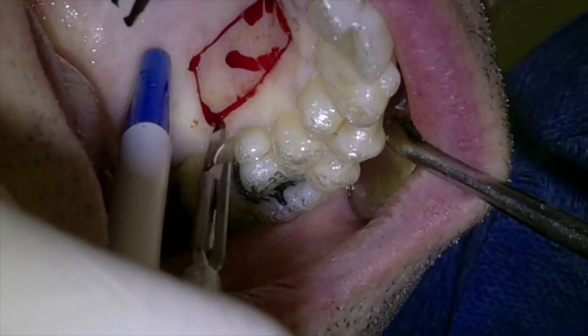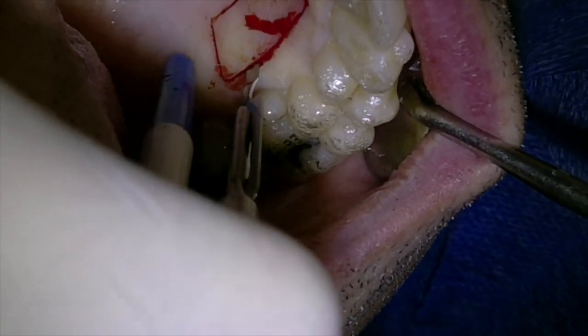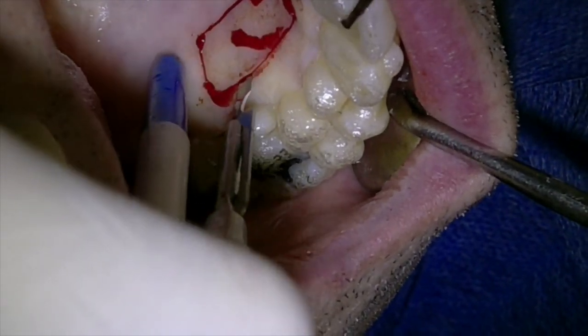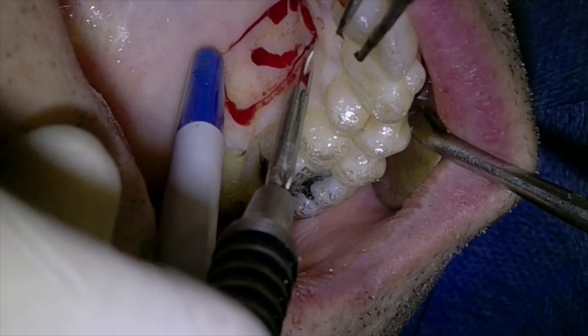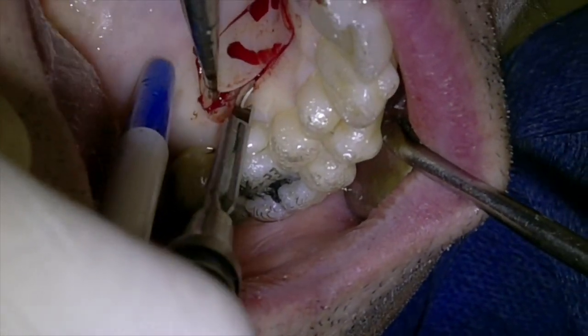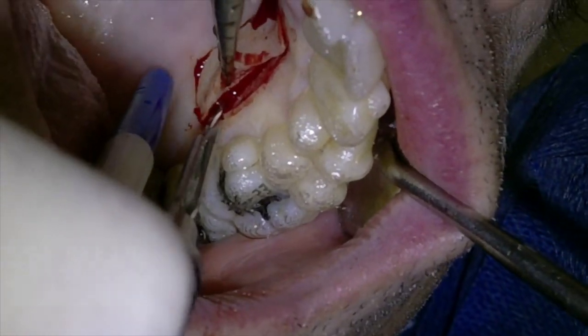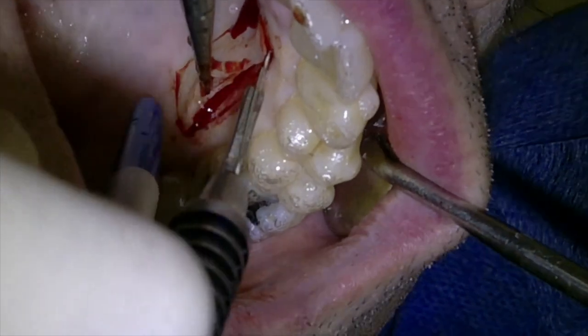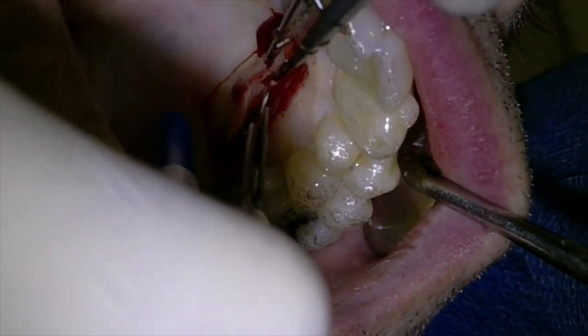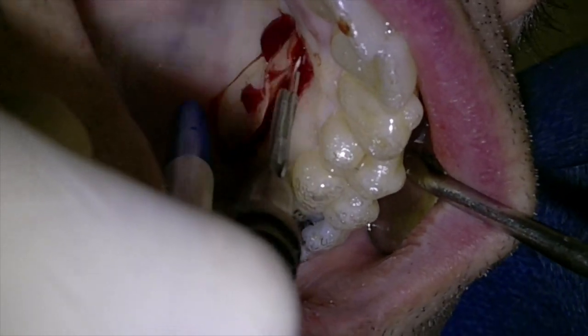At this point, you're going to turn the blade 45 degrees, about 30-45 degrees, and then you're going to start doing a split thickness flap, assuming the fact that you're going to need to go deeper than the epithelium, lamina propria, and submucosa. So you're going to reach basically the deepest aspect without touching the bone.